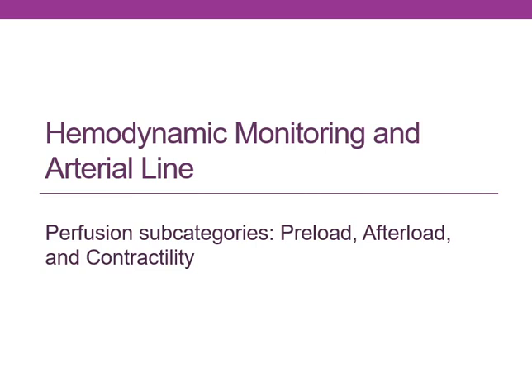What I want you to remember, though, is you have to correlate this data with your patient and that assessment of that patient. We don't just treat the monitors and the numbers, we do treat a patient. We need to correlate that because as we talk further, especially about arterial lines, we could have an error in the system. And if you just look at the numbers, you'll treat the patient for something that they don't have. So don't worry about that. You'll get good with that. So it's all the data we take in. We've got to recognize these cues, analyze it, and then come up with what's going on.